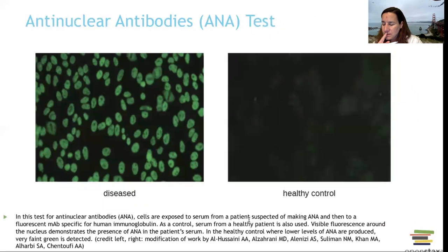We mentioned, was it last chapter? Was it chapter 19? It might have been. I can't remember her name, but she was having issues and they tested her and it turned out that she had lupus. Well, one of those tests when they determined that she was having hemolytic anemia, that her body was attacking its own blood cells, was the fact that they were looking to see if she had anti-nuclear antibodies, an ANA test, and that is going to use fluorescence around these guys.